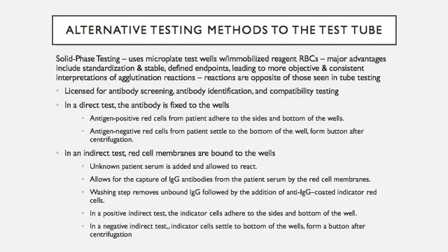In a direct test, the antibody is fixed to the wells. So antigen positive red cells from the patient are going to adhere to the sides and bottom of the wells because that's where the antibody is fixed.